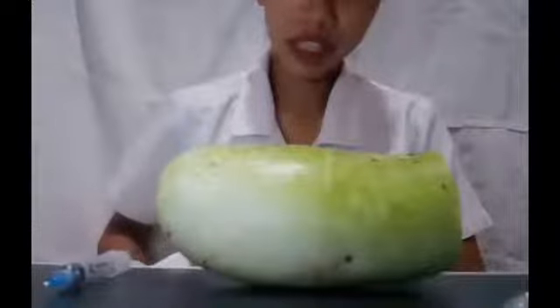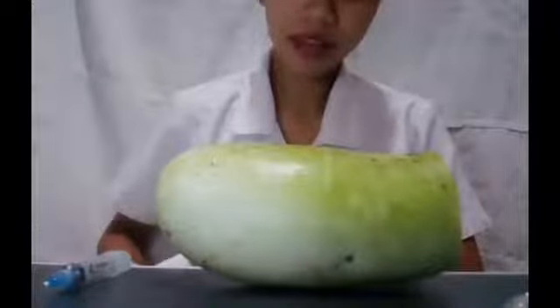And actually there are little stickers that are medication labels that you can put on the syringe. So just a safety thing, you should always think of it.